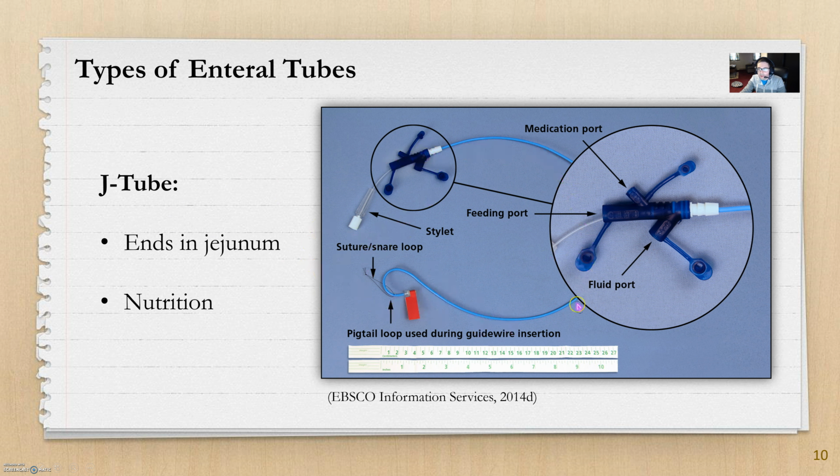And when we get into tube feed administration and tube maintenance, you'll know that you can flush these tubes, G tubes, and get aspirates back. The jejunum tubes, you don't usually get an aspirate back, so you can't really pull back to test contents or anything. You don't get anything in return. So this is primarily for feeding, and it's usually to rest the gastric portion of your system by inserting it directly into the jejunum. It bypasses it.